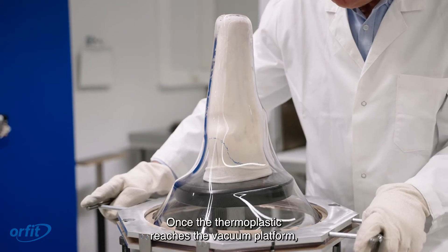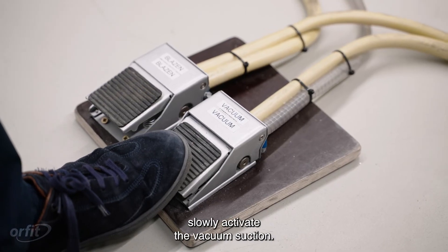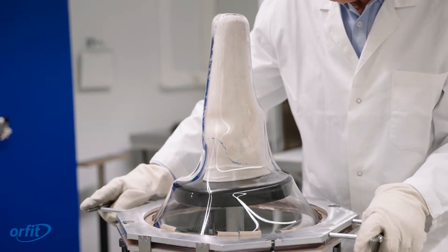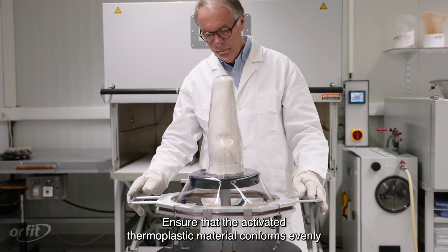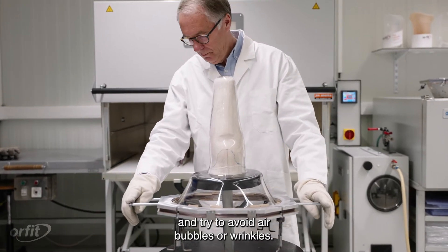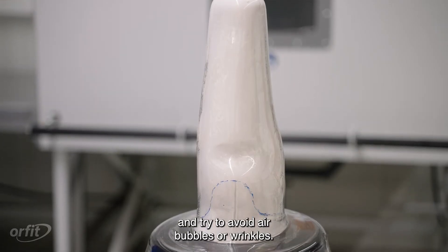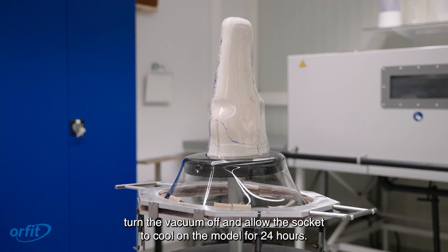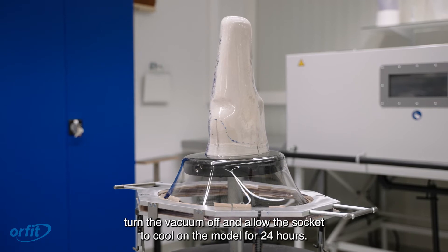Once the thermoplastic reaches the vacuum platform, slowly activate the vacuum suction. Ensure that the activated thermoplastic material conforms evenly and try to avoid air bubbles or wrinkles. Once the socket forming is complete, turn the vacuum off and allow the socket to cool on the model for 24 hours.